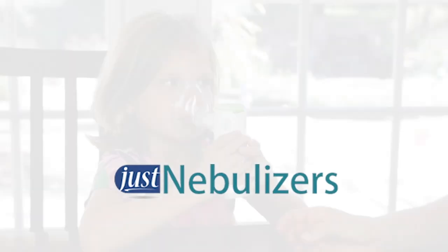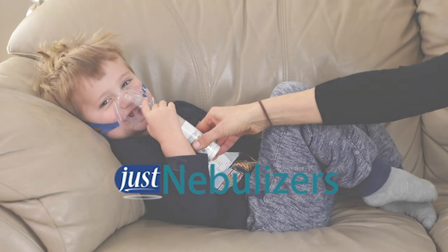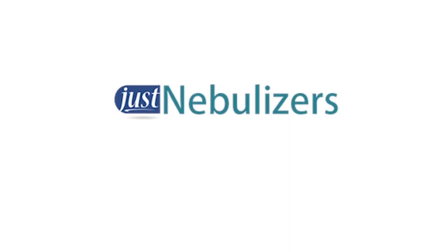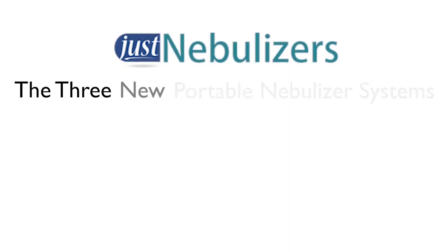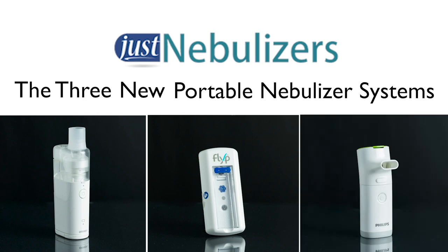We've had a slew of new products in the last year and we wanted to take the time to go over these products and compare them in detail. In this video, we will be discussing the three new portable nebulizer systems: the Omron U100, the Flip, and the Innospire Go.